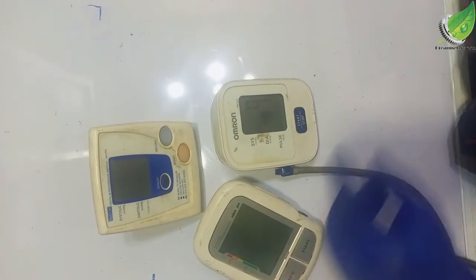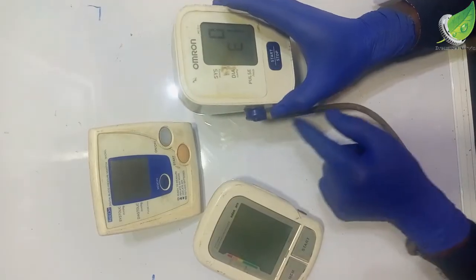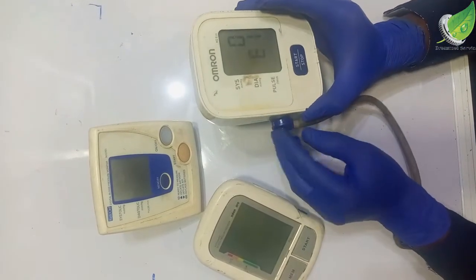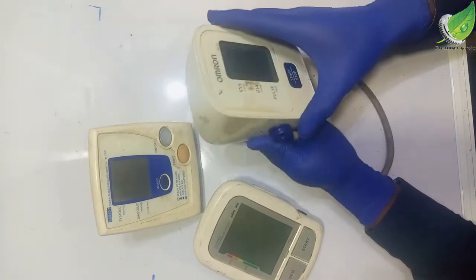Another thing you want to check is the hose going into the machine from the cuff. If this is loose, it's going to give you the error E1 because the air is not able to go through the way it ought to.